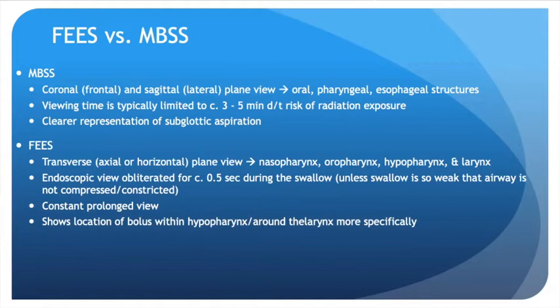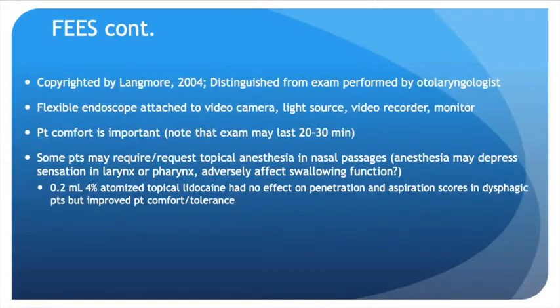FEES, on the other hand, gives you a transverse, axial, or horizontal plane view. You can look at the nasopharynx, the oropharynx, the hypopharynx, and the larynx. The view of the endoscope is obliterated for about half a second during the swallow itself, unless the swallow is so weak that the airway is not sufficiently compressed or constricted. And you can have a prolonged view of these structures. These exams might last 20 to 30 minutes, in fact. It can show the location of the bolus within the hypopharynx and around the larynx more specifically. And you can use it for biofeedback as well, trialing a variety of different strategies and maneuvers and seeing what works best.